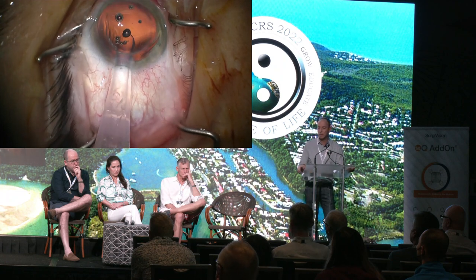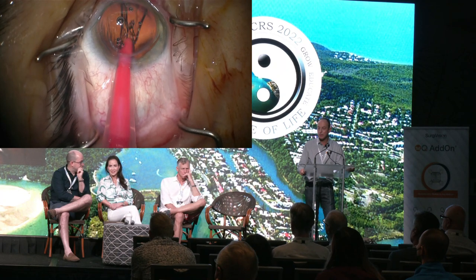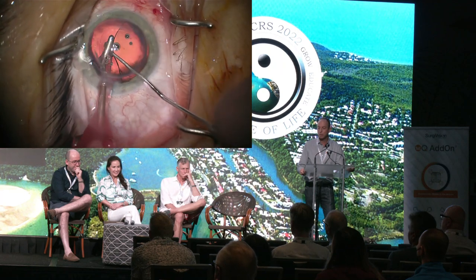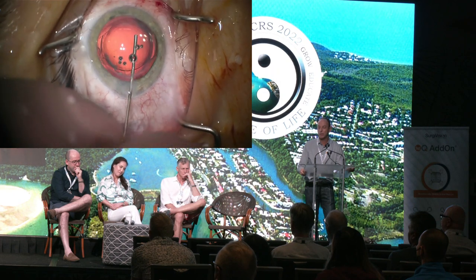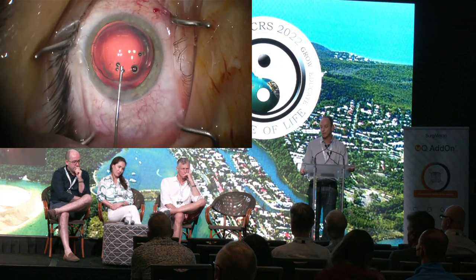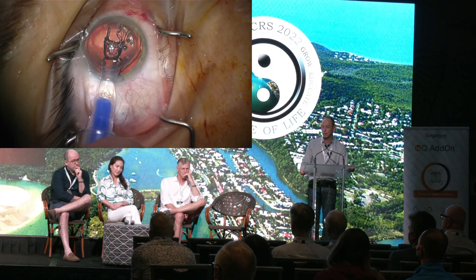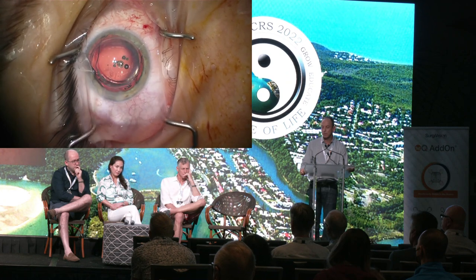This is the monofocal going in — that is the Biflex lens. Once that's in, all the viscoelastic is removed as if it was the end of the procedure, and then reinserting viscoelastic for the second procedure, so you know where your viscoelastic is and you don't have to go under the lens. Aiming at the iris plane, letting it unfold slowly, and then dialing it in.